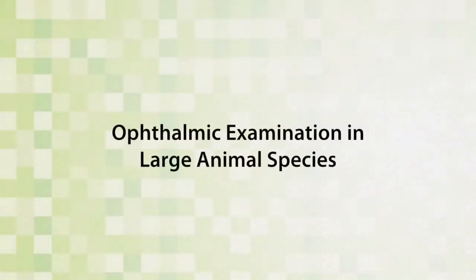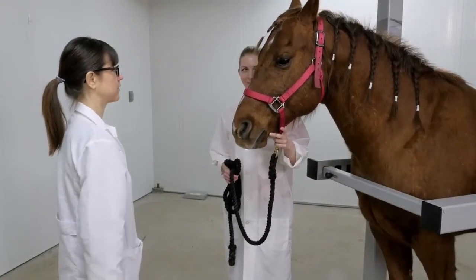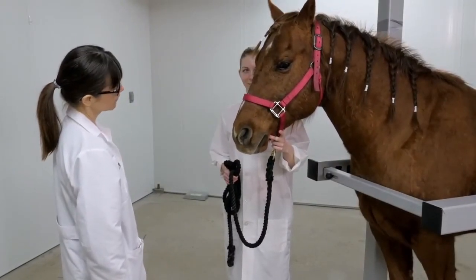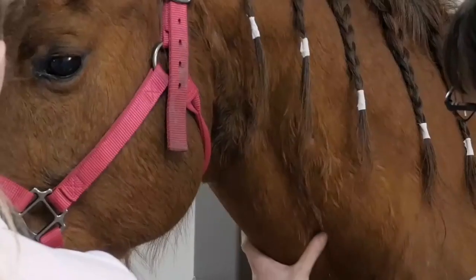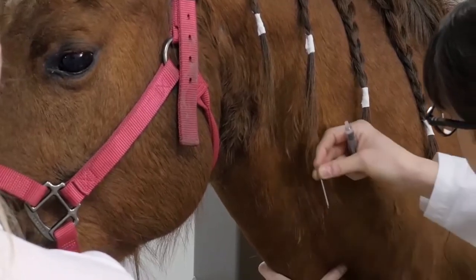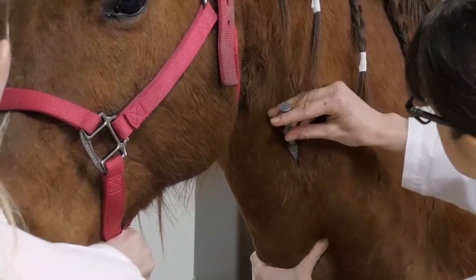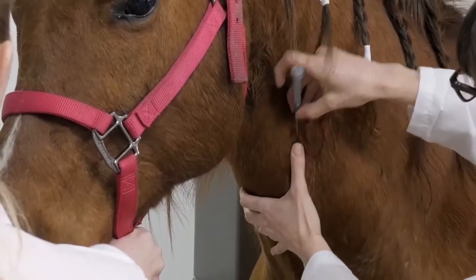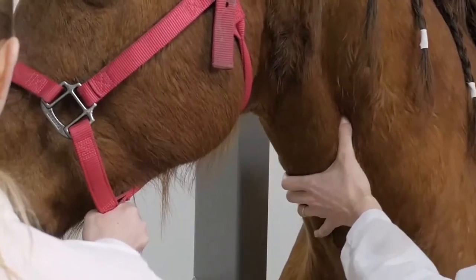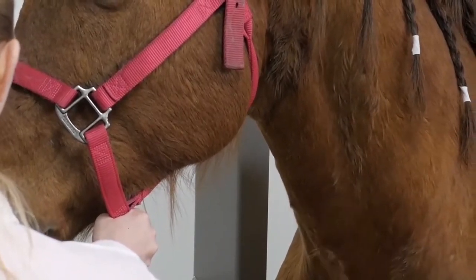As I have mentioned, there are some essential differences in the ophthalmic examination in large animal species. The ophthalmic examination in large animals should ideally take place in a darkened stall, stocks, or examination room to minimize distractions and interfering reflections. After the distant and neuroophthalmic examinations have been performed, the animal should be sedated with a short-acting sedative, such as intravenous xylazine at a dose of 0.5 milligrams per kilogram. And an auriculopalpebral nerve block should be performed to provide paresis of the orbicularis oculi muscle.